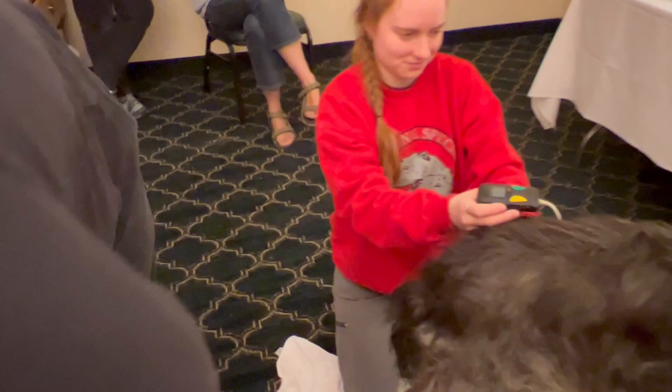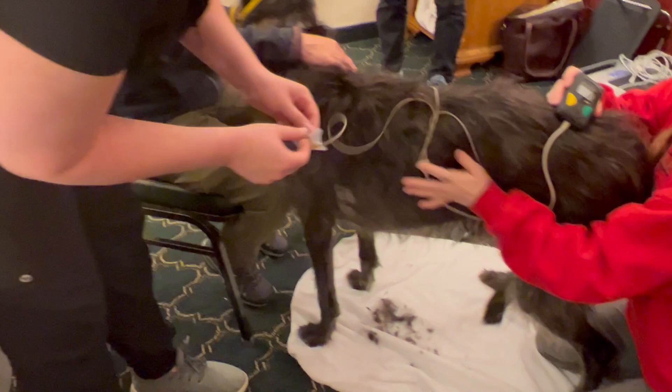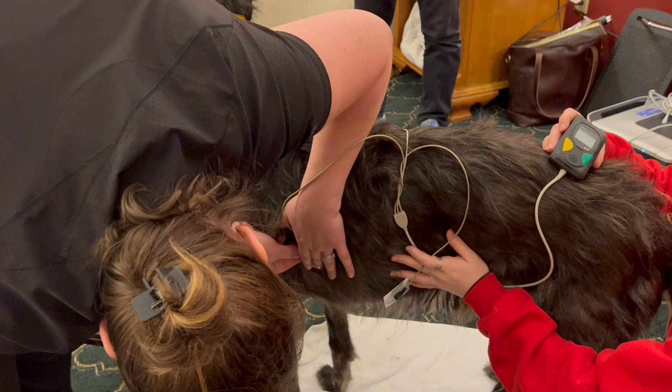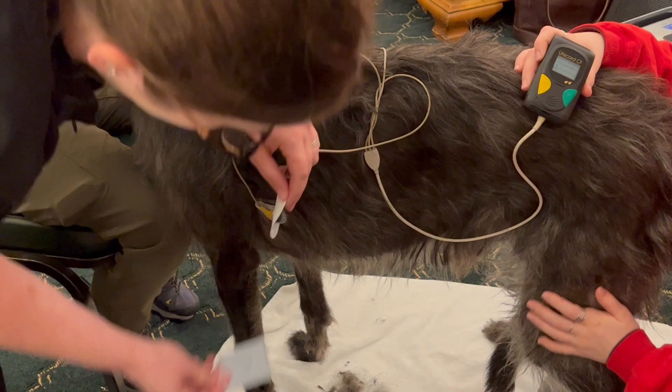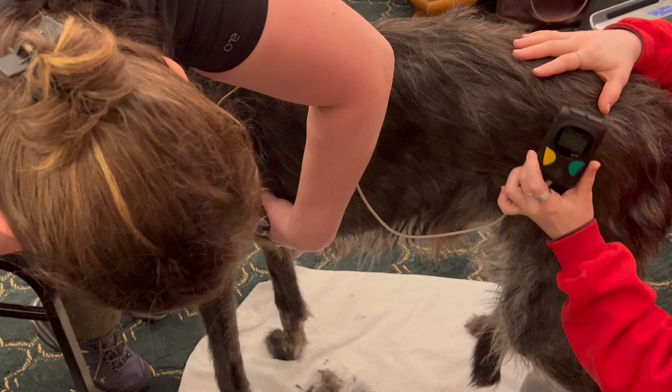I'm going to do the same thing on the other side. Yellow is on top and green is on the bottom — grass is on the ground, so green is on the bottom. Having a nice clean surface helps that.